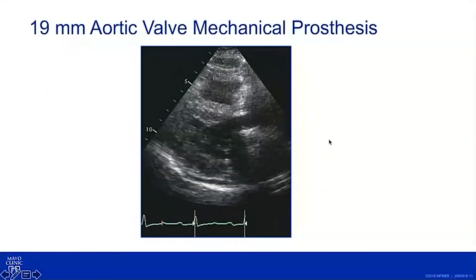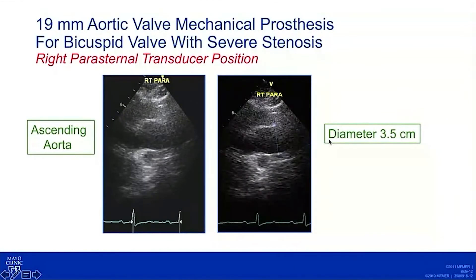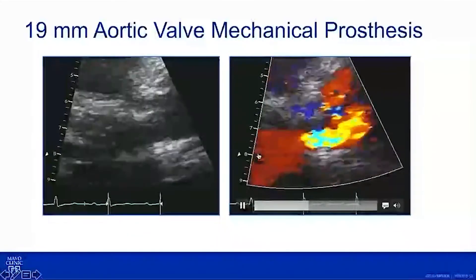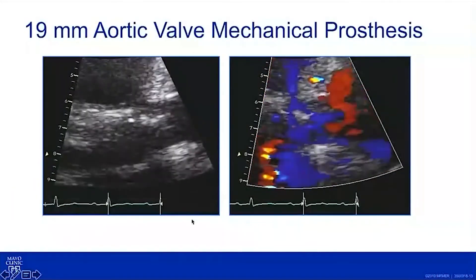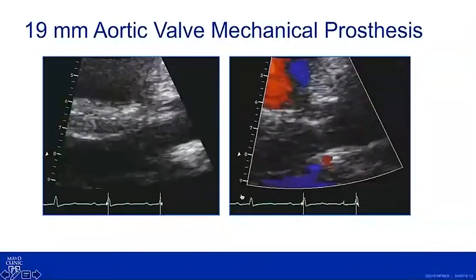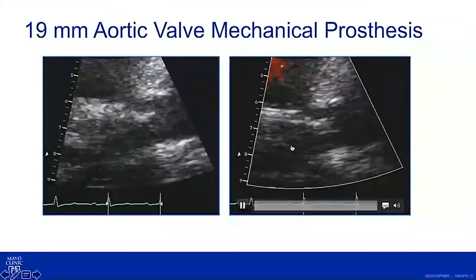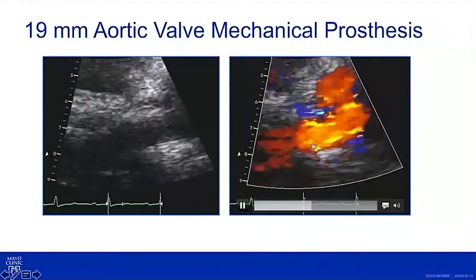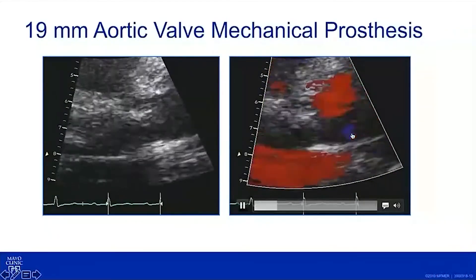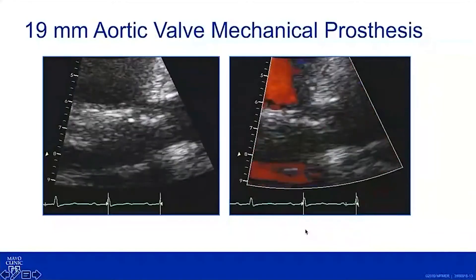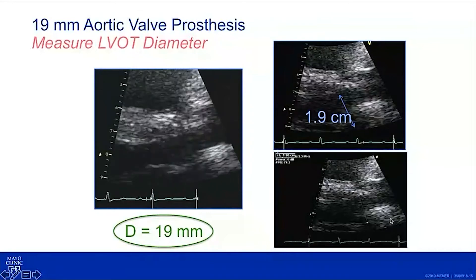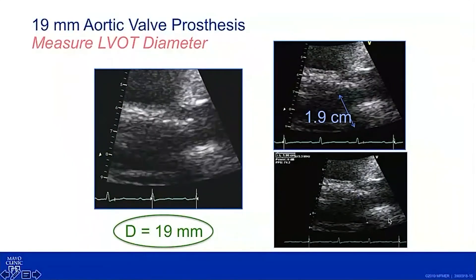Here is her pre-dismissal echocardiogram. She still has normal LV function and an aortic diameter of 3.5 cm. It's difficult to get images of the bileaflets, as is often the case with smaller prosthetic valves, but the color flow doesn't accelerate until the level of the prosthesis and then doesn't get turbulent — it's pretty laminar flow, which is reassuring. Same in short axis, with no AR; we couldn't even see the little normal leakage jets.